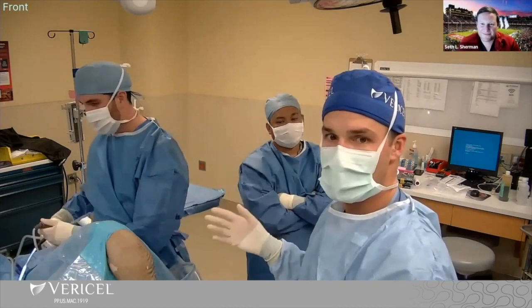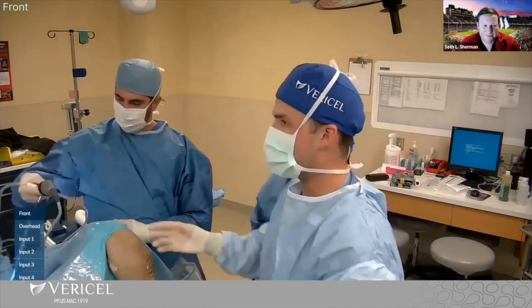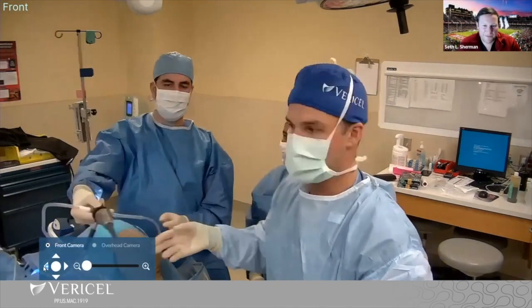Let's go to the scope views. We've already done a lot of this ahead of time, so that will hopefully save us some time.